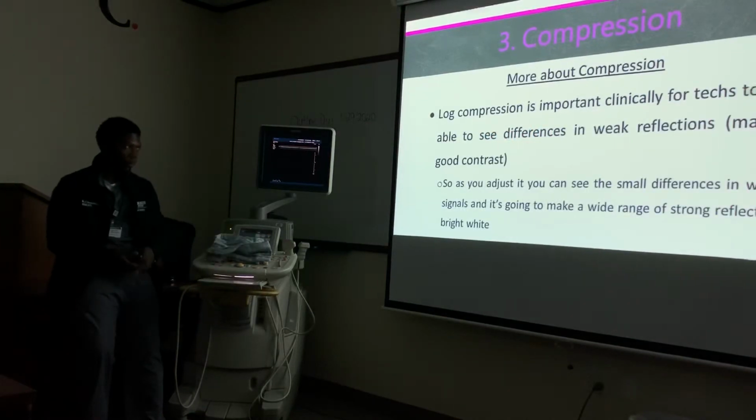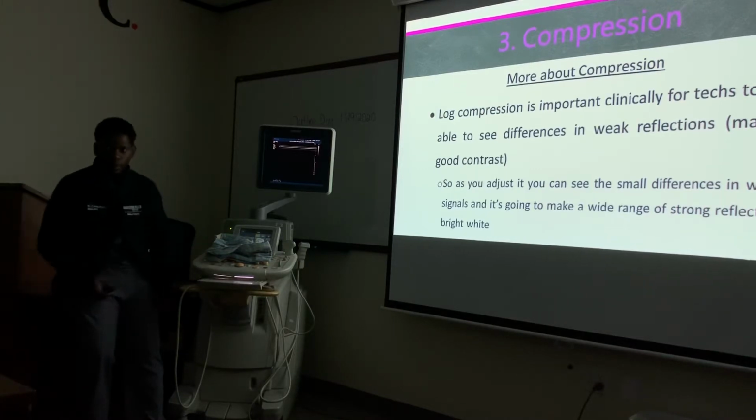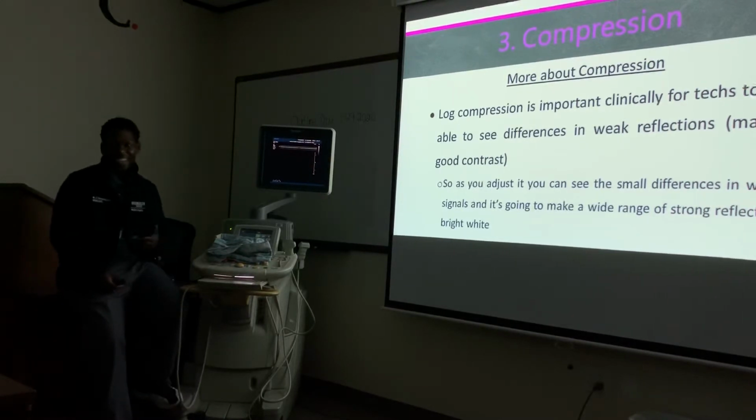A little bit more about compression. Log compression, remember that's a synonym. What's the other synonym? Dynamic range. What's our synonym for compensation?